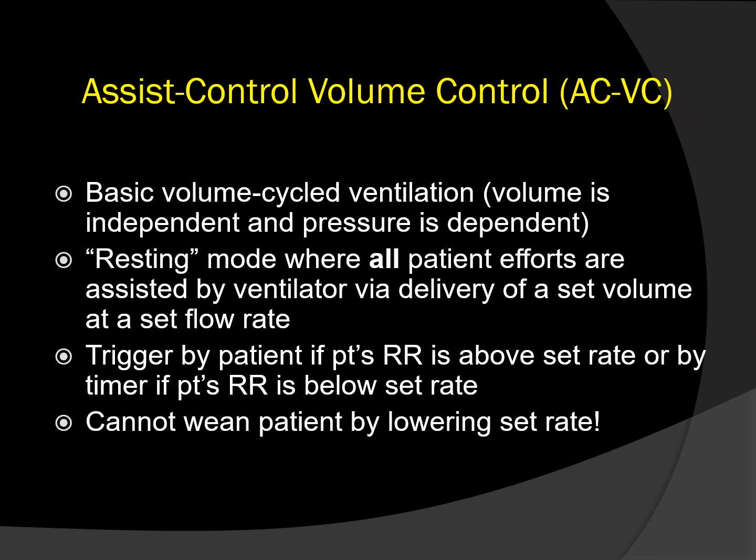We cannot wean the patient by lowering the set rate. For example, if someone's breathing 20 and the set rate's 12, and then we lower it to 6, they're just going to continue to breathe at 20. They won't even know we were in the room.